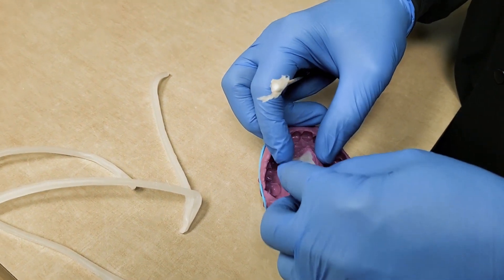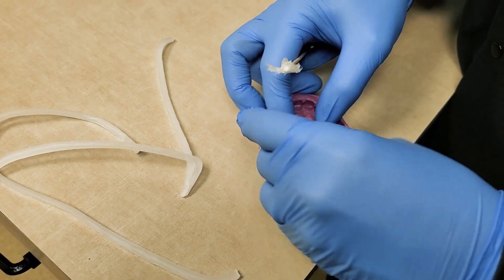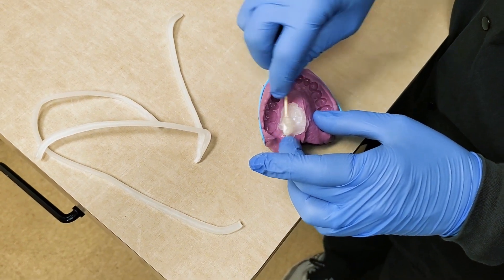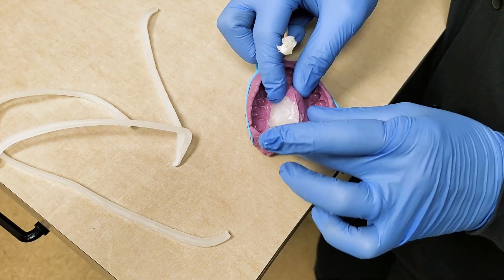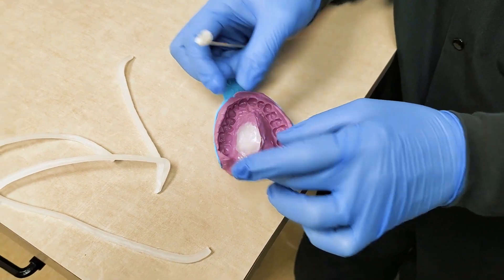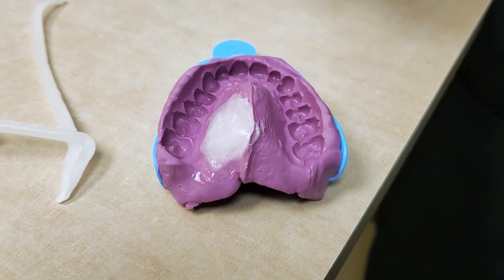We'll put it in place — there we go — and then put a little bit of vaseline on the surface just so it doesn't stick to the stone and is a bit easier to separate. The next step is my trusty sidekick Vanessa will pour this up and make this vacuform matrix, a little suck-down, to help with the surgical procedure.